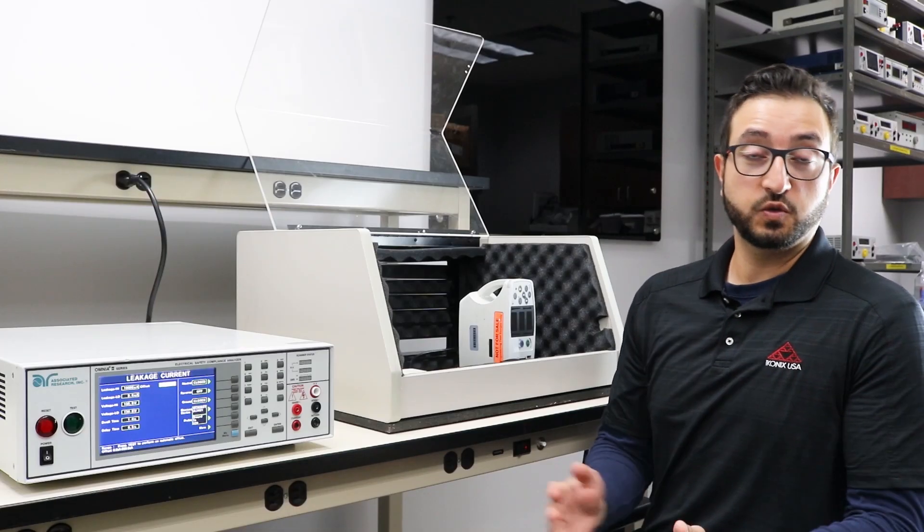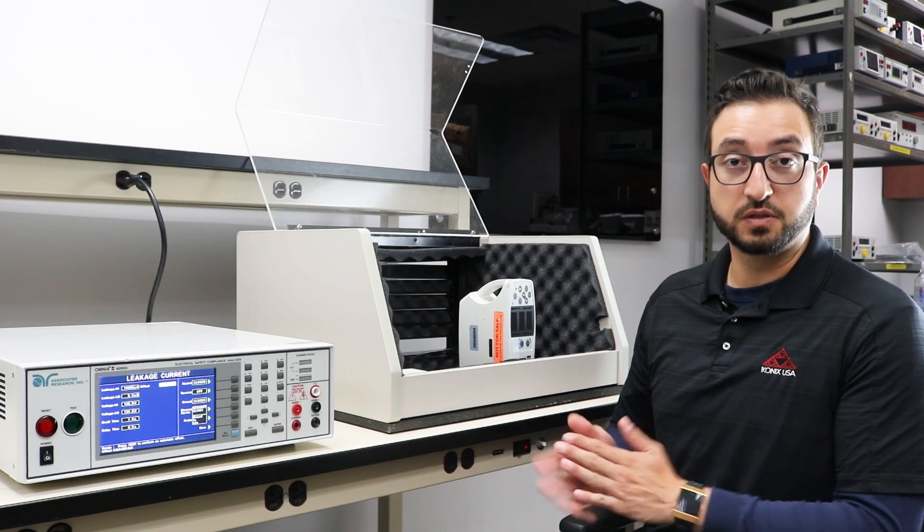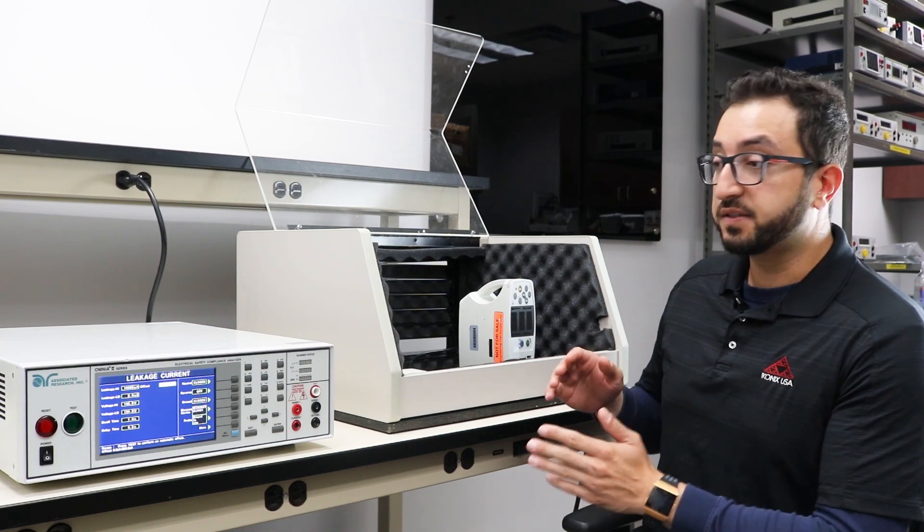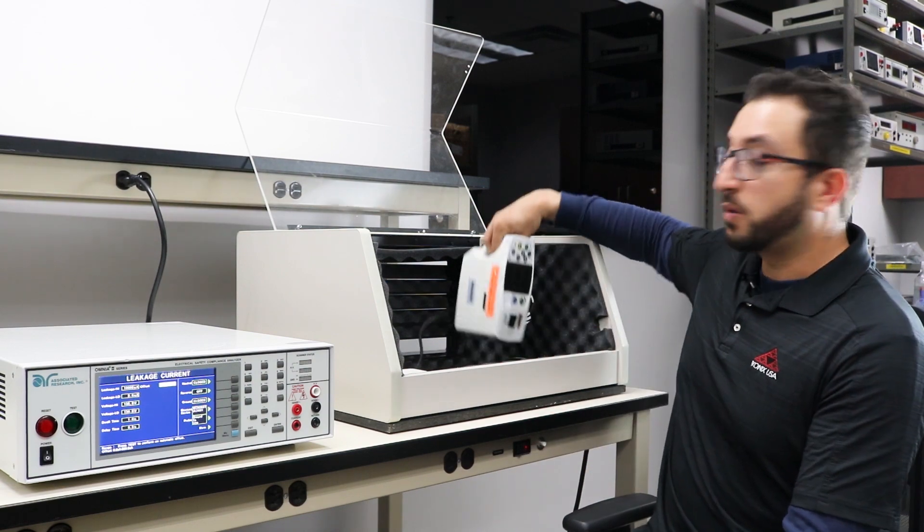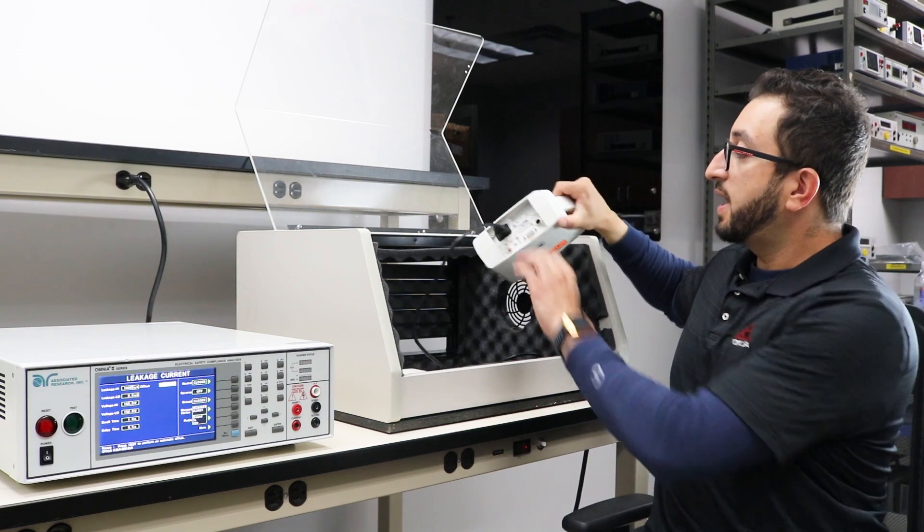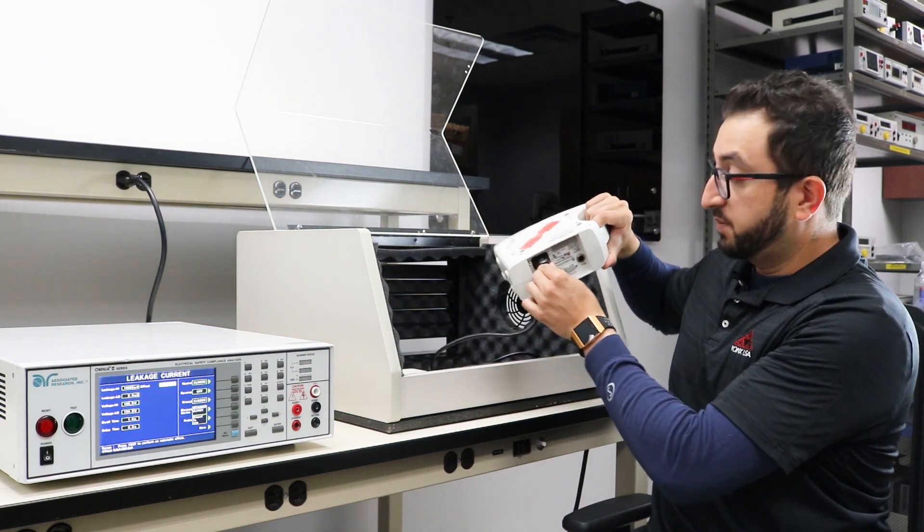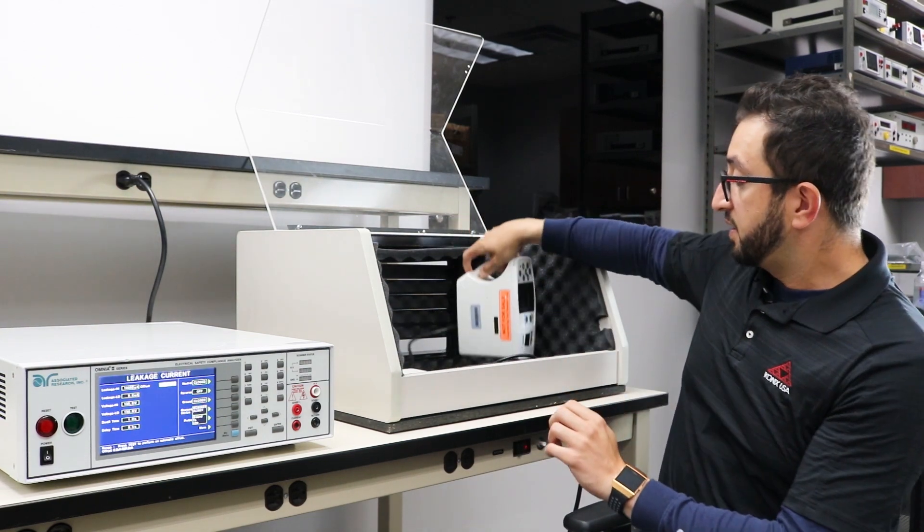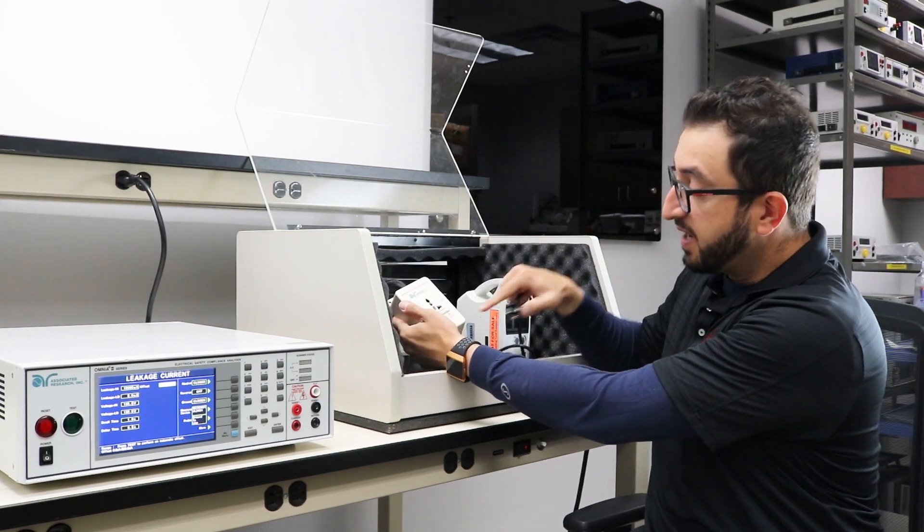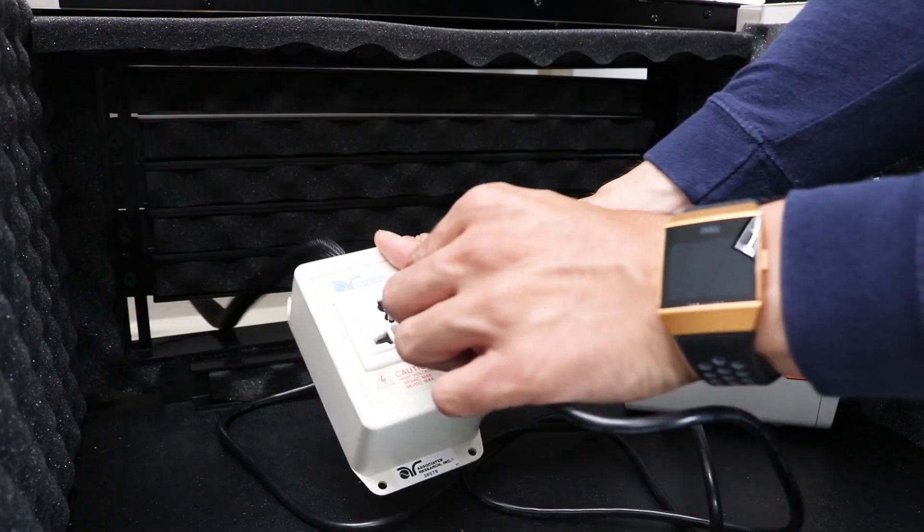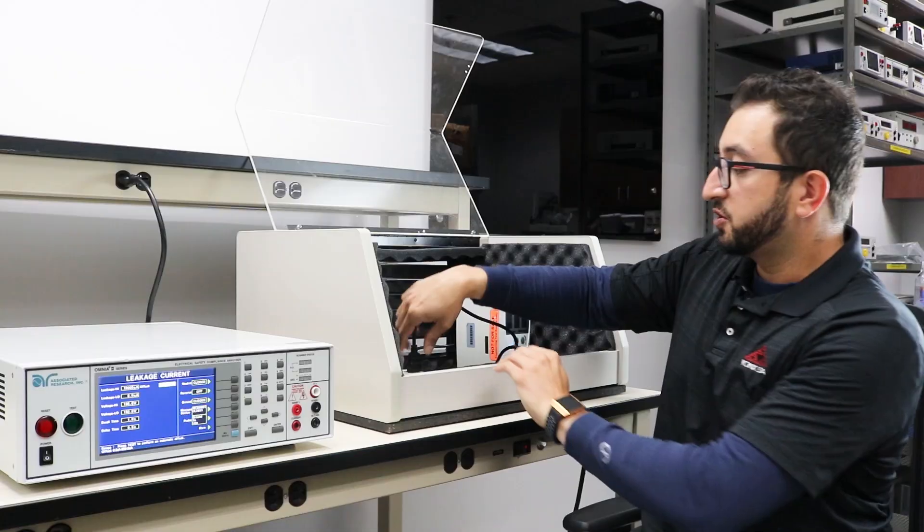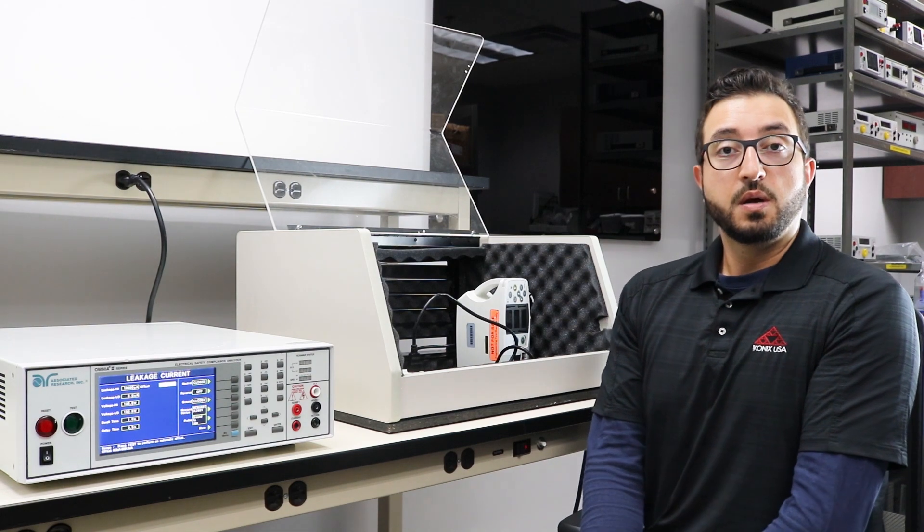Now we're ready to make the necessary test connections for performing an earth leakage test on our device under test, which in this case is a small medical device, a Class 1 medical device. I have the line cord of this device plugged into the back side of the device, and the other end of the line cord will be plugged into the adapter box of our electrical safety analyzer. With these connections we are now ready to perform the test.